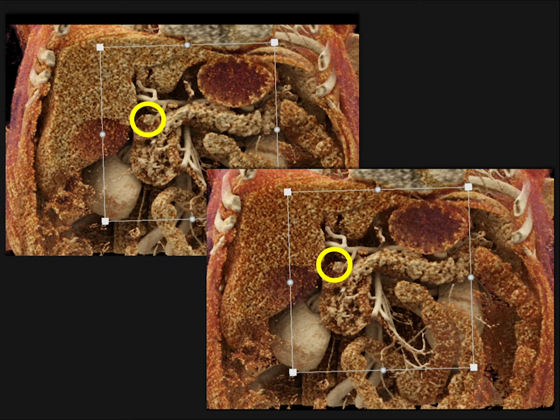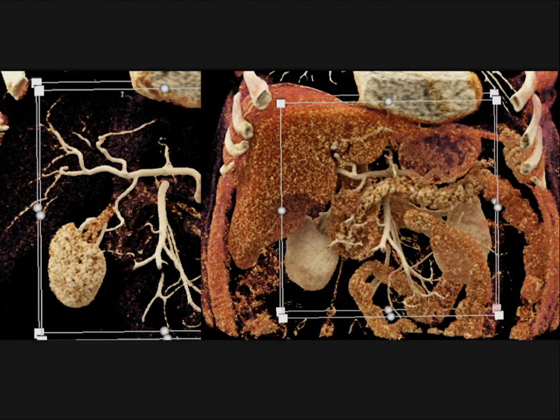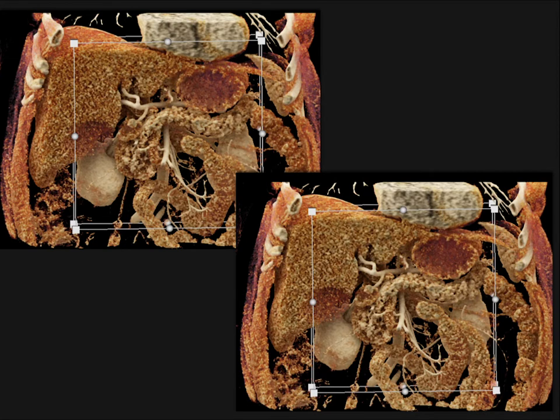You see how obvious the lesion is? Now, we are trying to use cinematic as a way of accentuating tumors that tend to be overlooked, but this is a great example of something that commonly would be overlooked. If you didn't have the dual phase, if you didn't have the vascular enhancement, because of the fast injection and the early scanning, you would miss these lesions. And again, if you didn't give oral contrast, you would miss this lesion. And here it is again, showing you from the celiac to hepatic to GDA to the different branches in place, and again showing you the lesion.